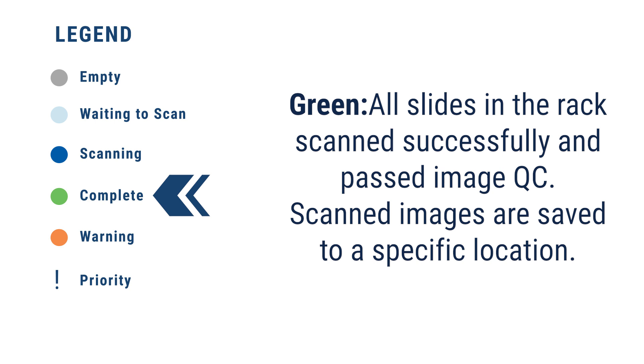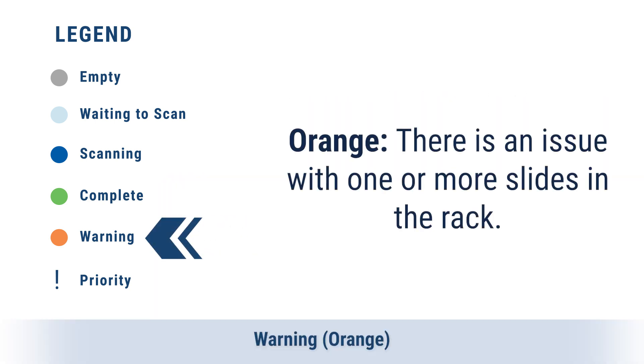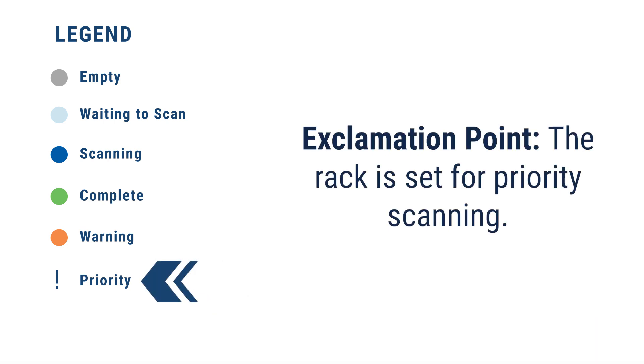Scan images are saved to a specific location. Warning — Orange: there is an issue with one or more slides in the rack. Priority — Exclamation Point: the rack is set for priority scanning.